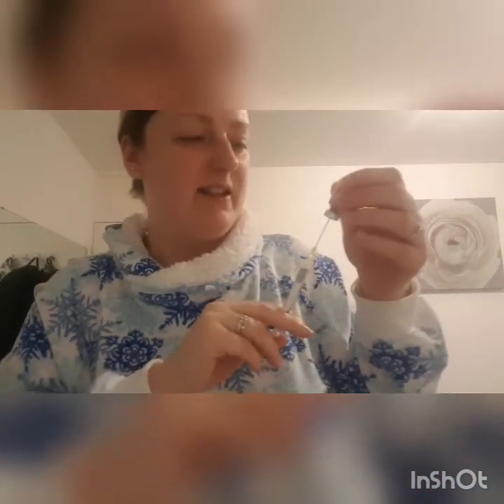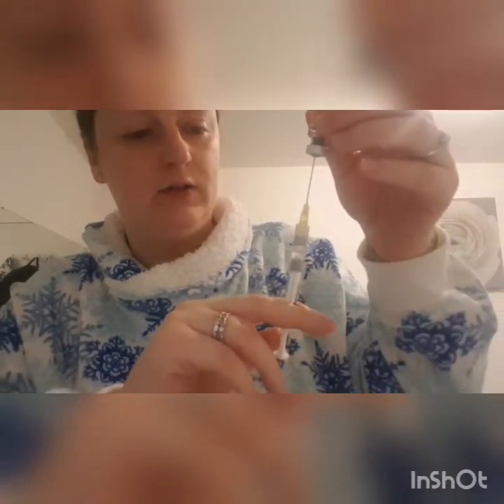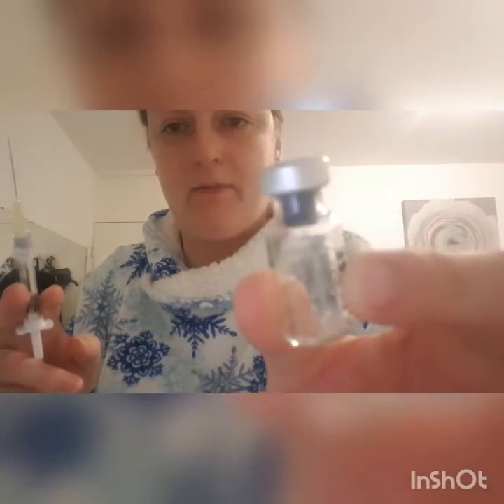So now I'm going to tilt the bottle this way, and there actually is a gap in the rubber cap. You won't be able to see this on the camera, but I am literally pulling the needle almost as if it's going to come out of the rubber cap, and then I'm going to let it start filling up, and it's actually doing it on its own. As you can see, it's dropping on its own. I can tug it a bit more to help guide it. I've just got to be a little bit careful. There we go. And as you see, the bottle is empty. Replace the cap with the needle. So that one is now done.